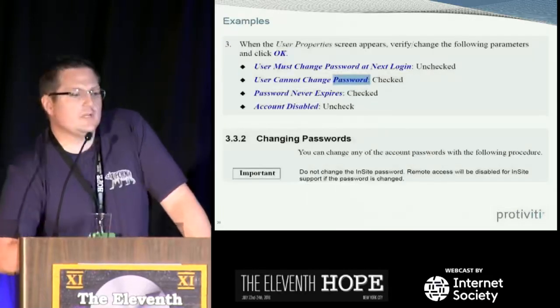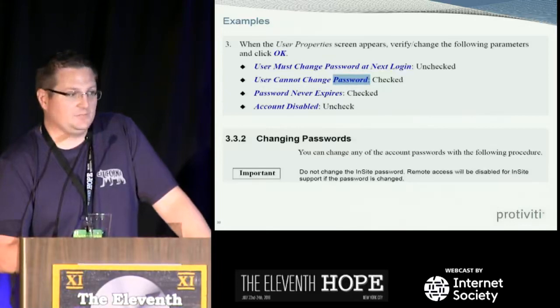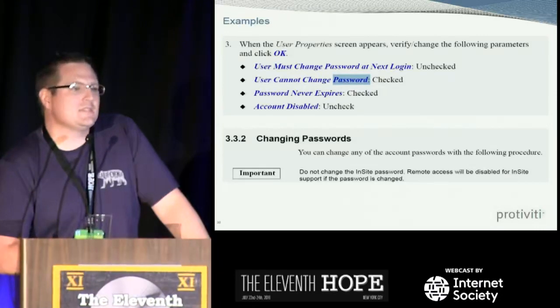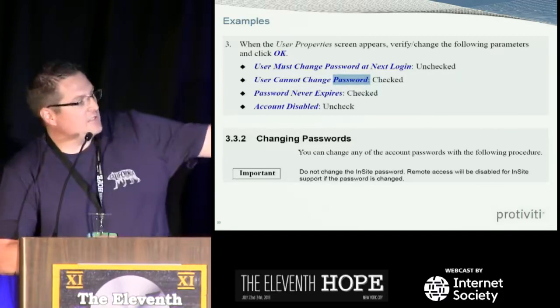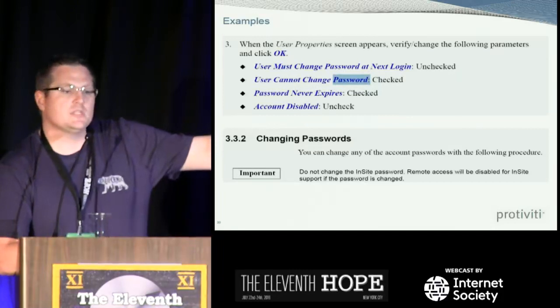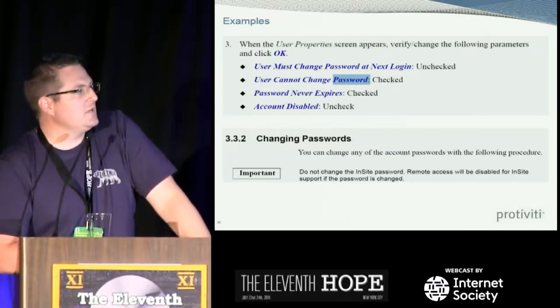So if you wanted a customer to make this a default password and you wanted to ensure they would change that password, would you tell them to check user can never change password? Would you tell them to check password never expires? That's not something that's indicative of a default credential. And so these credentials, whether they're truly hard-coded on the back end, in some cases they definitely are, or they just are in the instructions told like this, important, do not change the password or we will not support you. What hospital organization is not going to listen to that, especially when we put it in big and bold and say, don't do it or we're not going to be able to support that system. So there's still issues that we see that are common here.